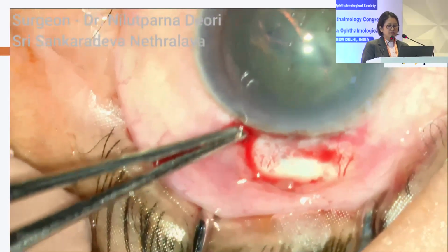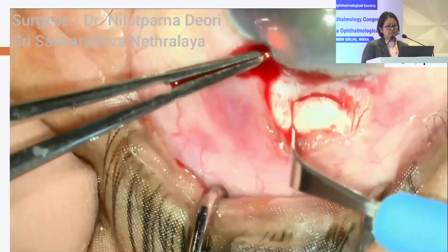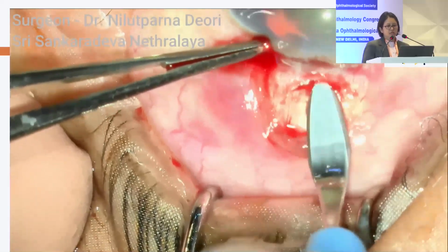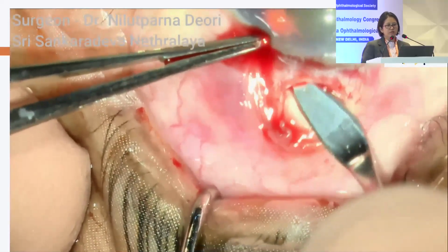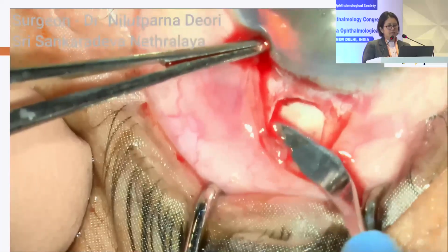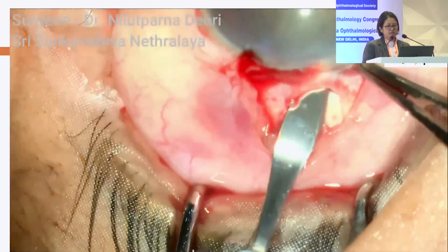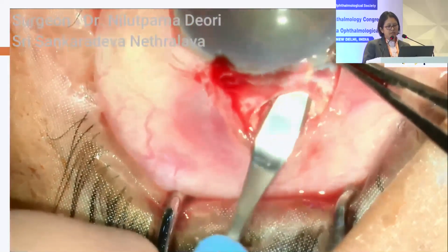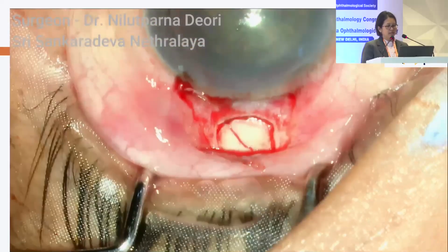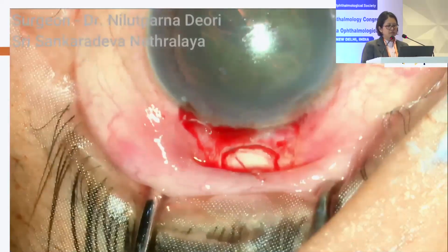So this is a 2mm marking that we have done, 1.5mm behind the limbus. You make an incision here, and then you place the side incisions on either side of the 2mm incision. Now, if you do not have a 2mm crescent, go sideways on either side. Why am I saying this? Because if you want to create a 2mm incision and go with a larger crescent, 2.8 or 2.2mm, you will actually cut the ends and you will end up with more than a 2mm incision, because your sclera is elastic, it will give way, but it will contract back again when it is healing. So you are actually not doing a 2mm incision, you are making a 3 to 4mm incision. In order to avoid that, these back cuts are very important. It is also good in this situation if you are ambidextrous, so that you can use both hands, because this is a very small incision.